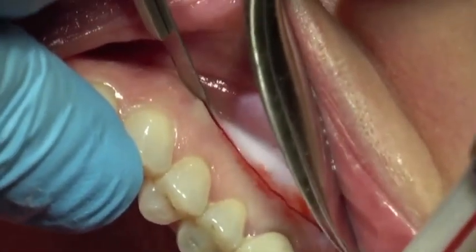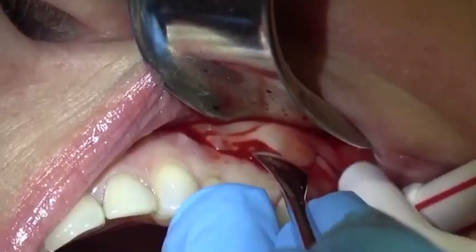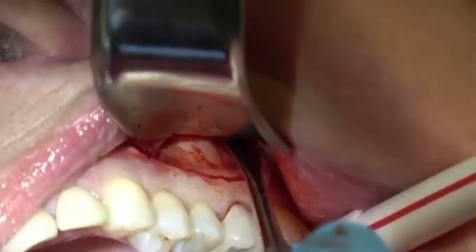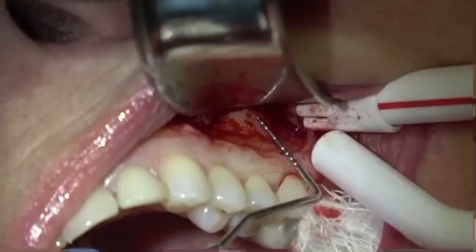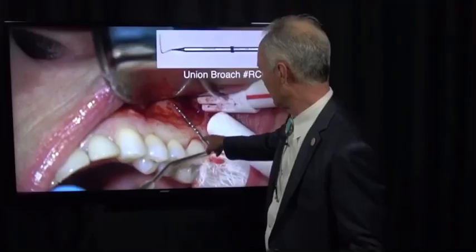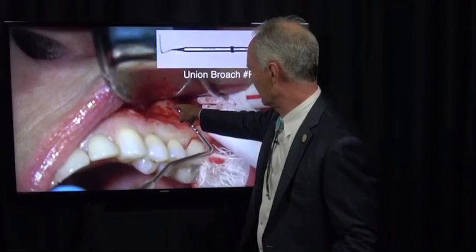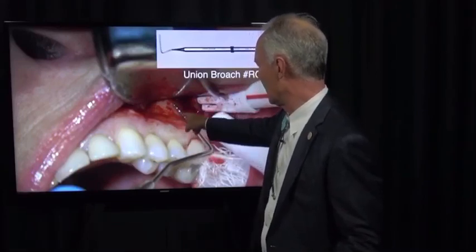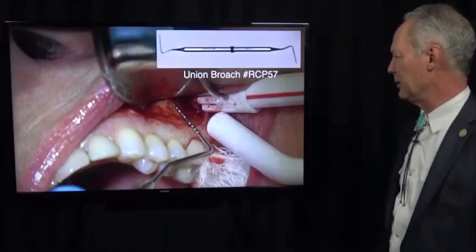The sutured flap is more stable. It's just a semi-lunar full thickness flap all the way to bone. This is a periosteal elevator, and now I'm measuring with my periodontal probe from the margin of the crown to the approximate location of the tip of this mesial buccal root — that's about nine and a half to ten millimeters.